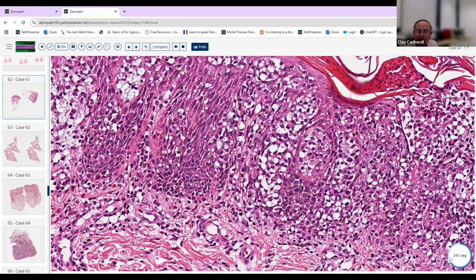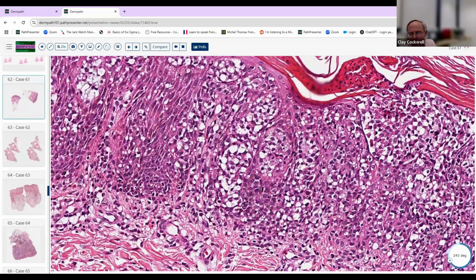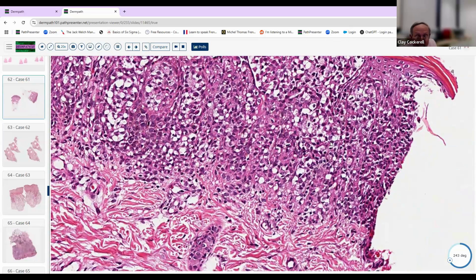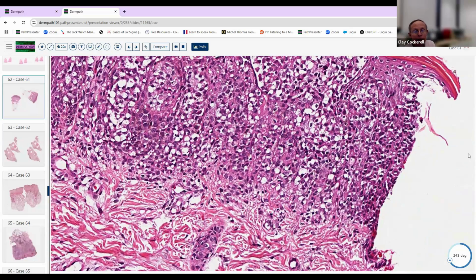You get several other choices here. You might say, well, gosh, could this be HTLV1 lymphoma, leukemia? That doesn't give you the reniform nuclei like you see here. This obviously also is not a good example of mycosis fungoides. They might show you something like this with a CD1a stain, and then maybe ask you some of those things in the differential diagnosis. But this is a nice example of Langerhans cell histiocytosis.